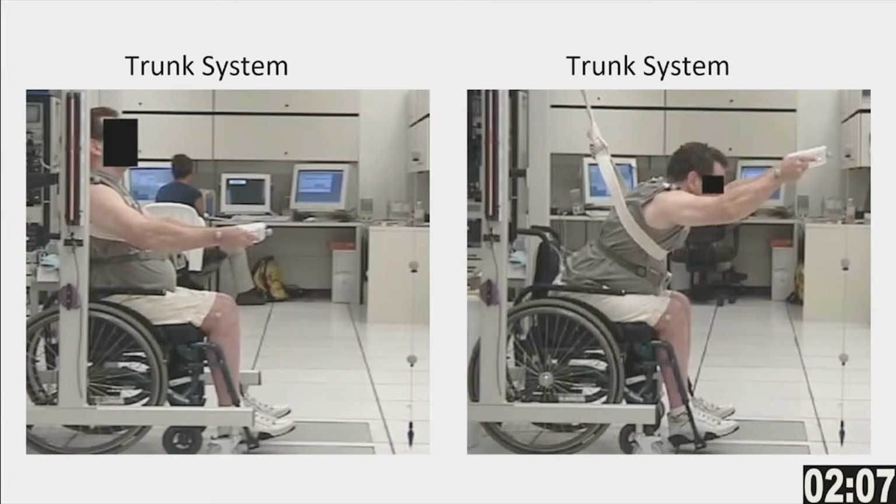The system I am trying to make is composed of three main components. There is a measure of trunk position, an initial command, and a controller. We can think of it kind of like navigating to the grocery store with your phone. Just as the GPS in your phone needs to know where you currently are in order to know where you need to go, so too must I know where the trunk is in order to tell it where to go. And this is done with a sensor that we place on the chest of the individual.